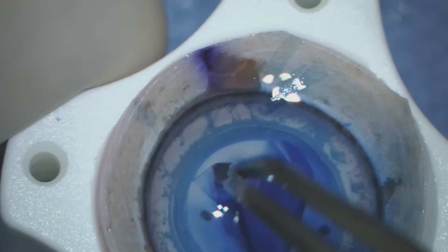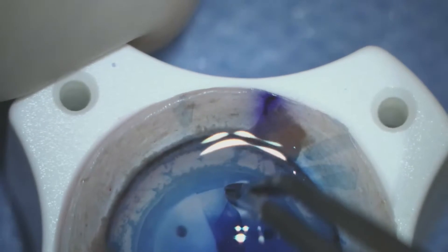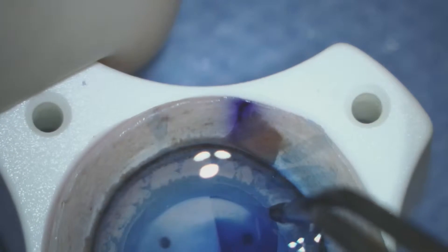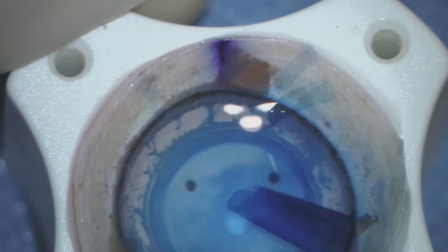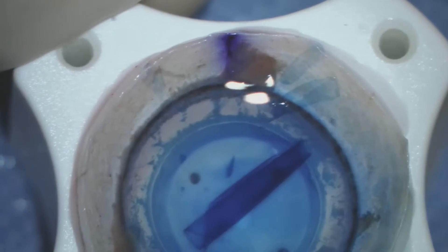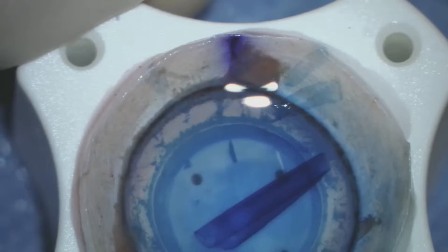Here we've turned our attention to the donor cornea and we're peeling away Descemet's membrane and endothelial cells which have been pre-marked to an 8 millimeter diameter. This layer of cells then forms a tight scroll which we float in balanced salt solution.